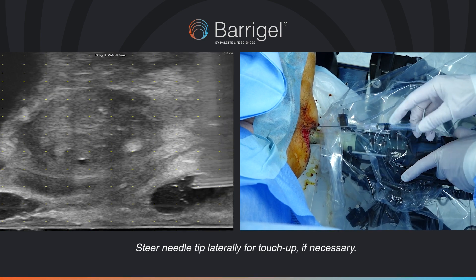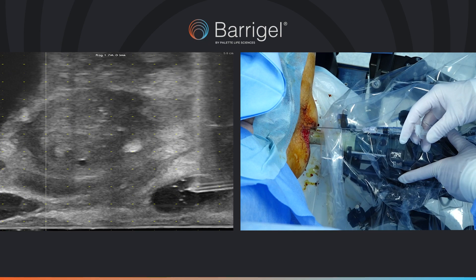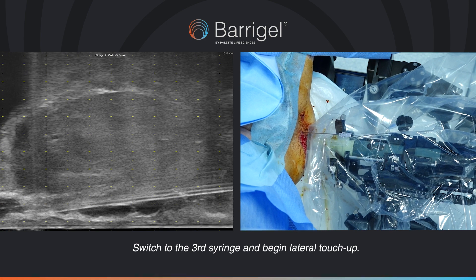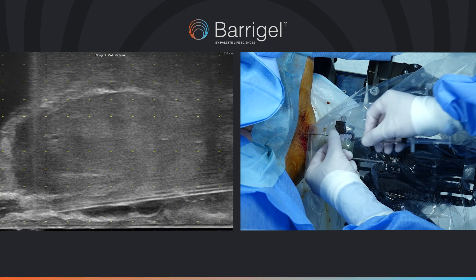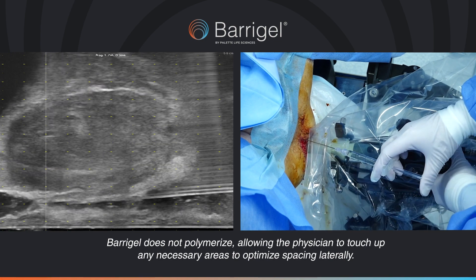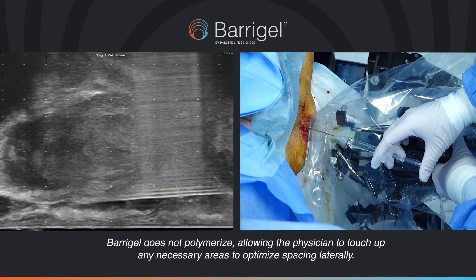Steer the needle tip laterally for touch-up if necessary. Switch to the third syringe and begin lateral touch-up. BaraGel does not polymerise, allowing the physician to touch up any necessary areas to optimise spacing laterally.